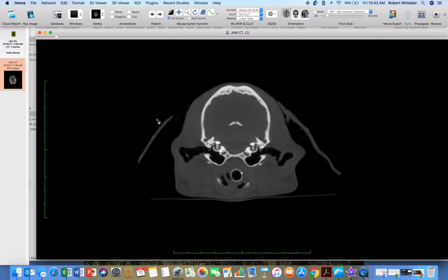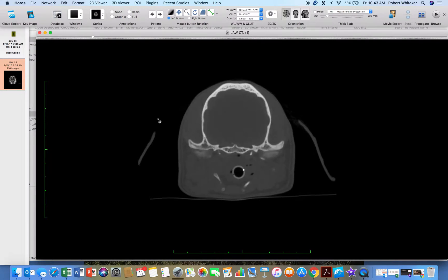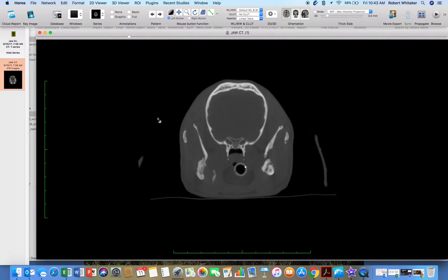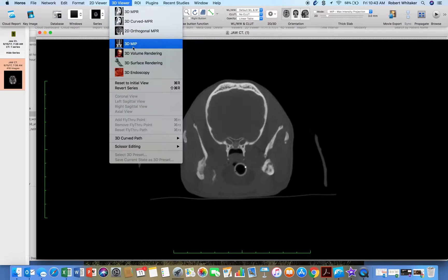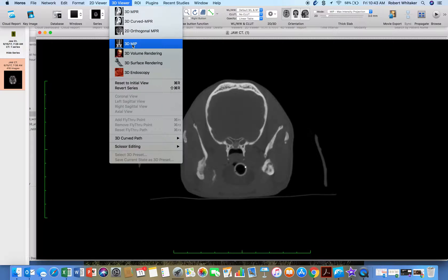So this is just only the axial view, but we go to 3D viewer. And we go to volume or MIP. Volume is color. MIP is black and white only.